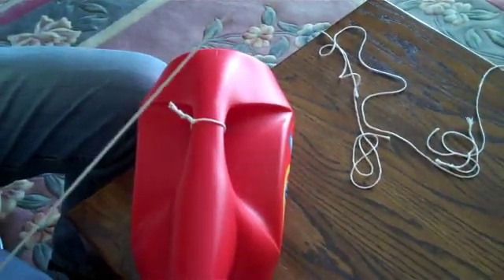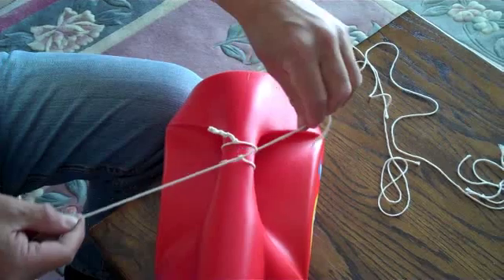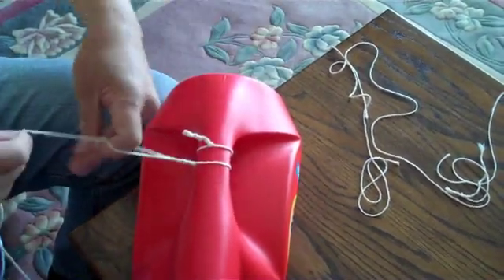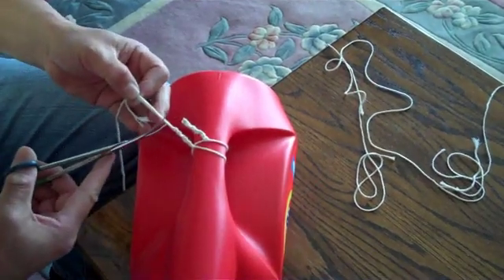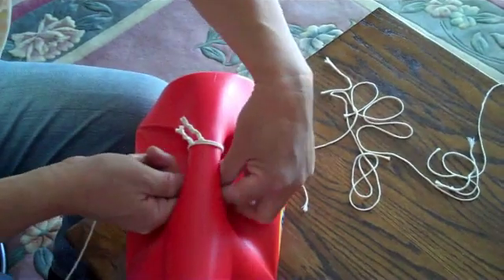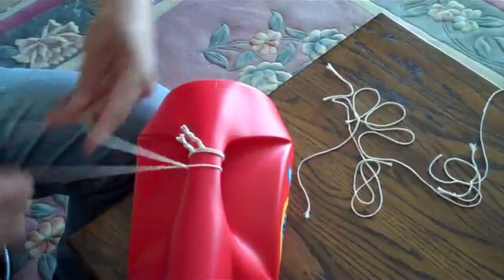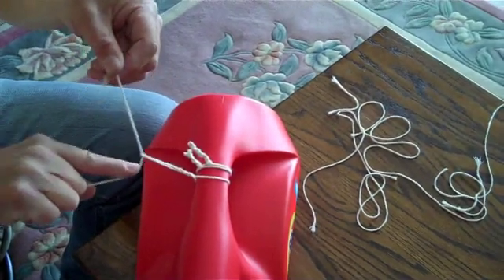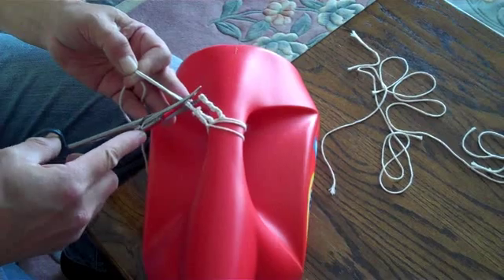One more time. Slide it down and cut. Okay, now go home and practice.